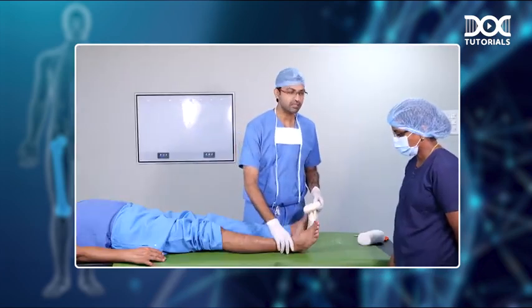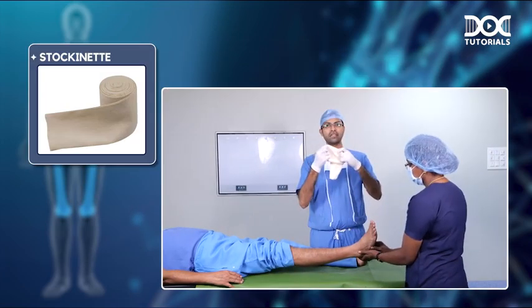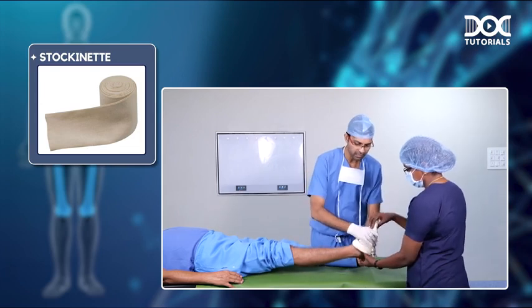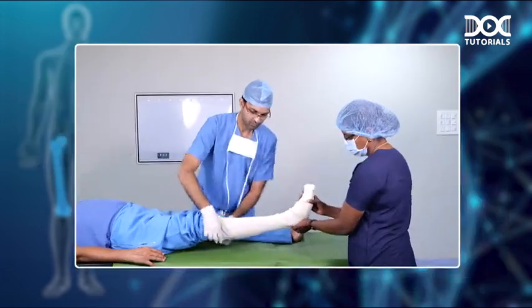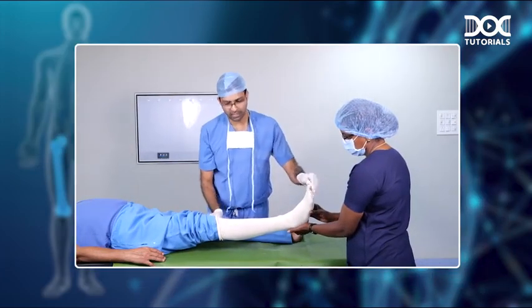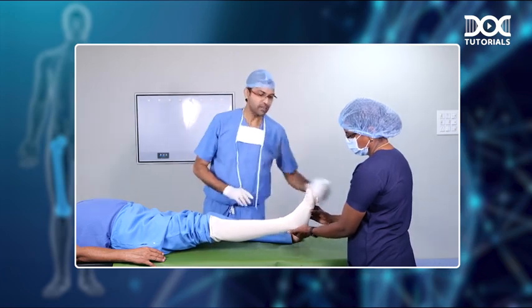Next, you can ask your assistant to hold the limb like this. Now this is your stockinette, which is a sock-like thing that you can put on top of the leg. This will protect the skin of the patient. Make sure that your stockinette is cut a little bit longer than your POP. Why that is important, I will show you in a bit. So you have done that.